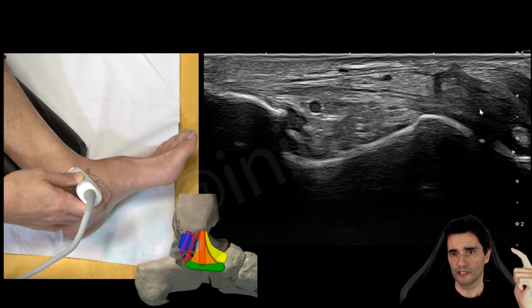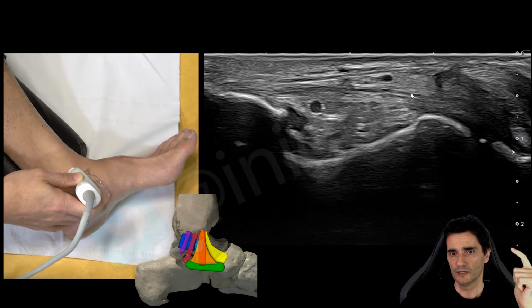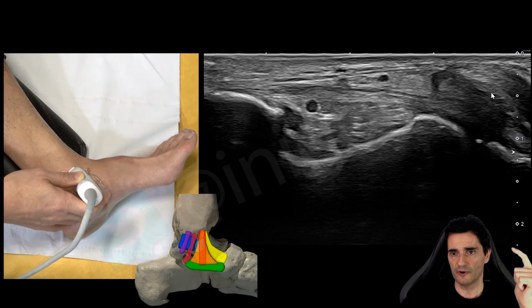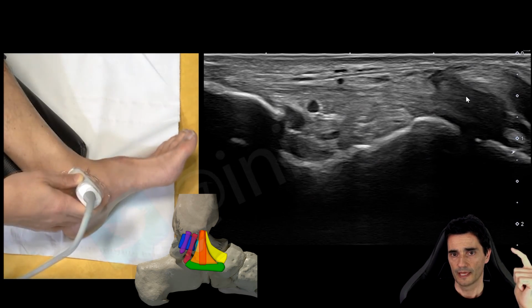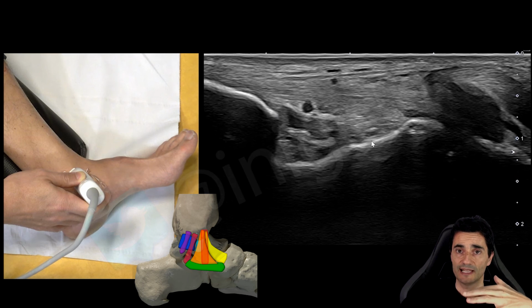There's no more a bony insertion of the ligament, but a ligamentous insertion of this ligament. This is the posterior tibialis above the spring ligament. And at this level, if we take a look in the deep layer, below the tibiospring ligament, we should be at the location of the anterior tibiotalar ligament in the deep layer.